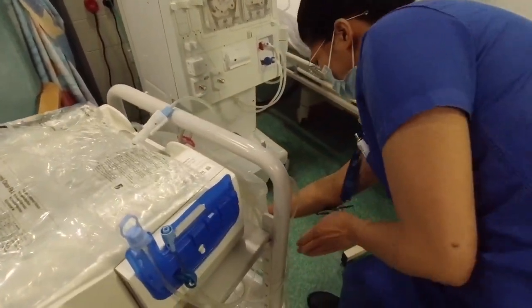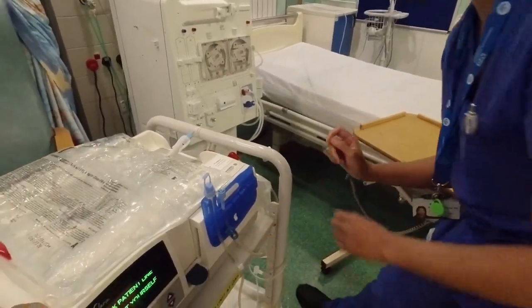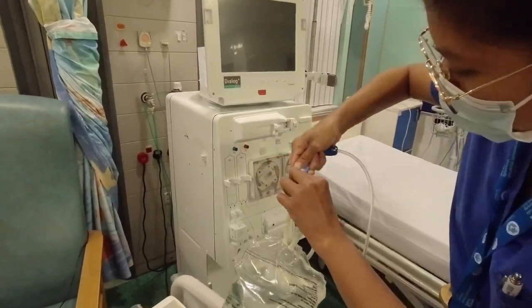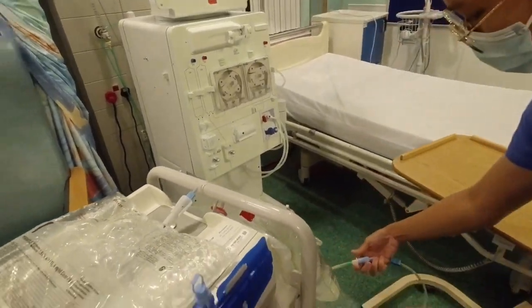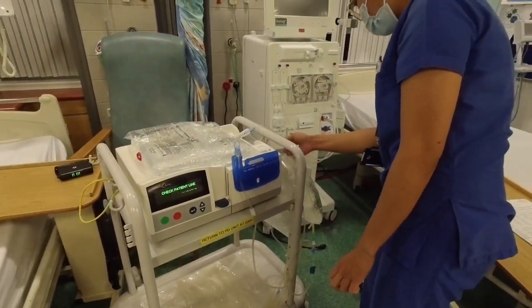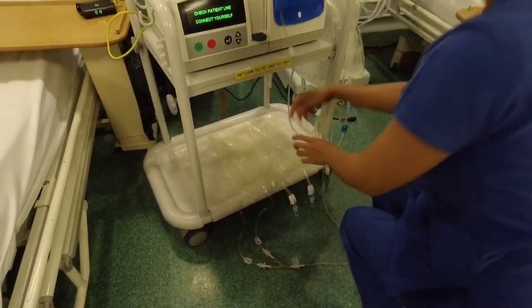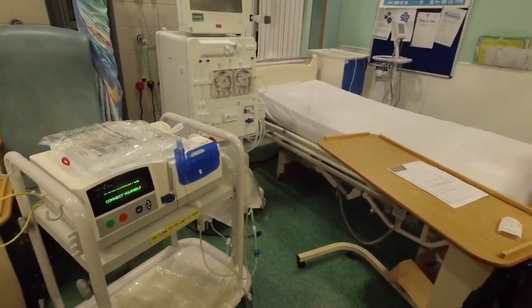So, ayan siya. Tapos, dahil meron ako, ang tawag dito kaya? Last fill. Last fill. So, ito siya. Blue. And then, here. That's it. Tapos, okay. Lahat, unclamp. I-unclamp ko pa, pwede? Oh, pwede. Kasi seal the unit. Clamp. Yeah. Unclamp. So, unclamp. Clamp. Tapos, ito sa patient. Unclamp, yeah. And prime. Then, that's it, prime. And now, well done. Okay.